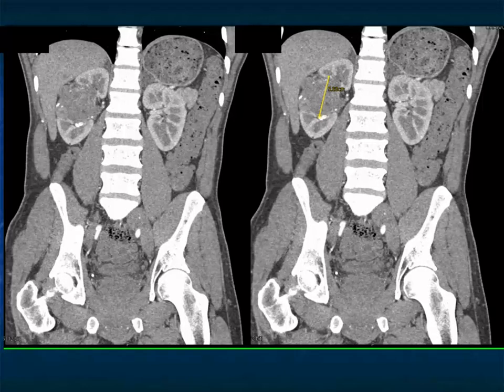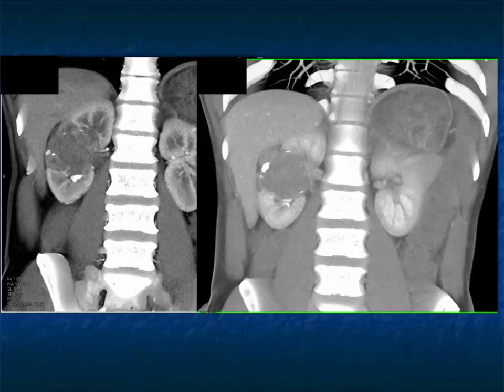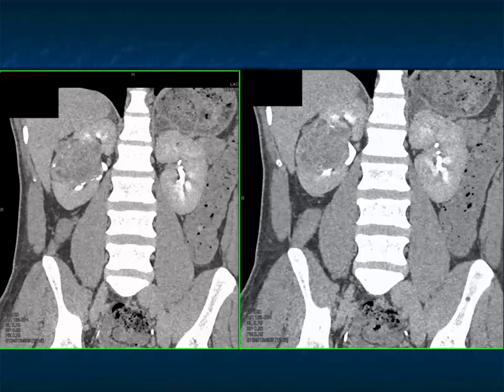Chromophobe is more common. Here's the lesion kind of centrally positioned, so it's going to be a very tough call if you even considered a partial. But now a hypovascular mass with coarse calcification, yes, you do need to think about papillary, but you've got to think about a chromophobe renal cell carcinoma. Here it is as we go from the arterial to excretory phase imaging using volume rendering, showing you those calcifications very nicely, distortion of the renal pelvis and calyces. Because of the central nature of this tumor, there's no way you can do a partial nephrectomy, and this patient had a right nephrectomy.